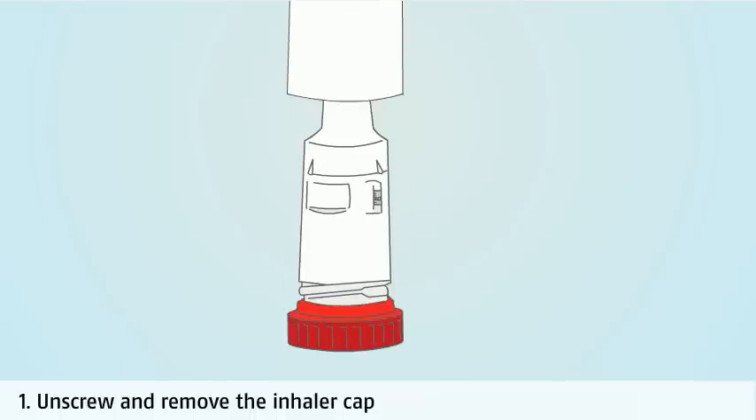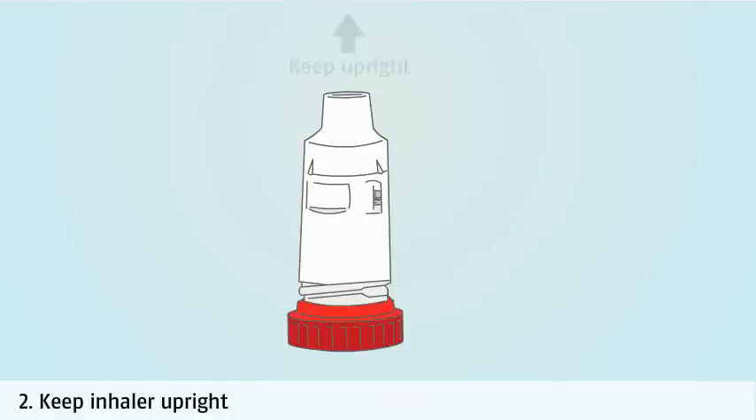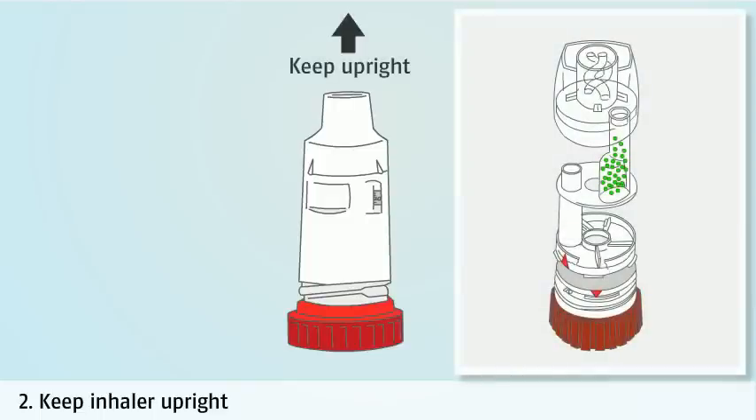Unscrew and remove the turbohaler cap. Put the inhaler onto a flat surface and keep it upright before filling the dosing chamber to guarantee a full dose. If the device is not upright, the chamber will not fill correctly.